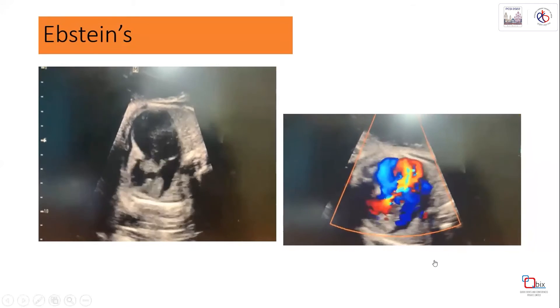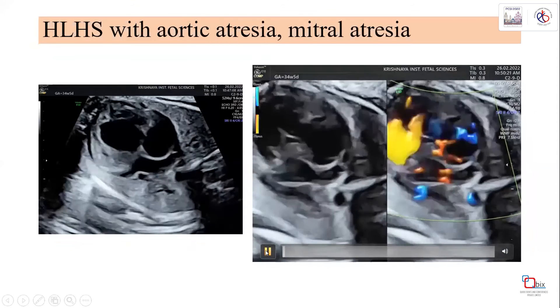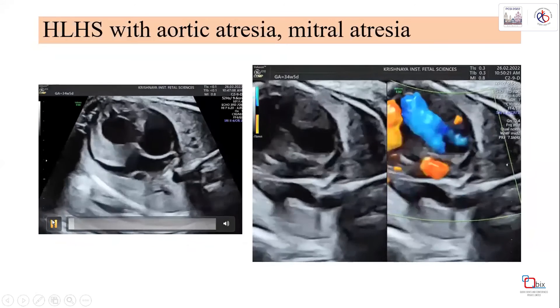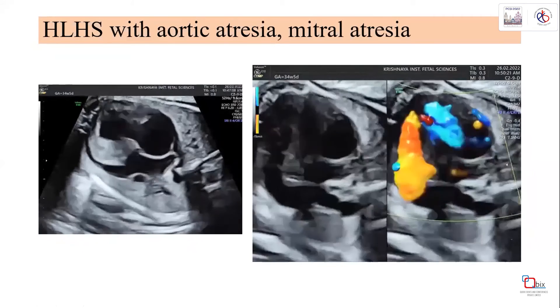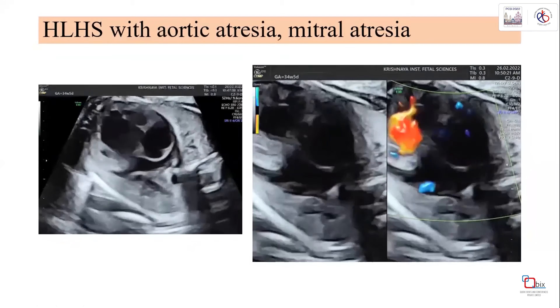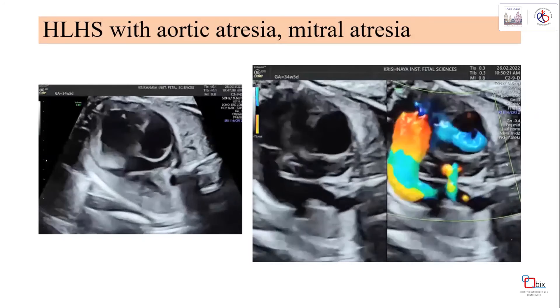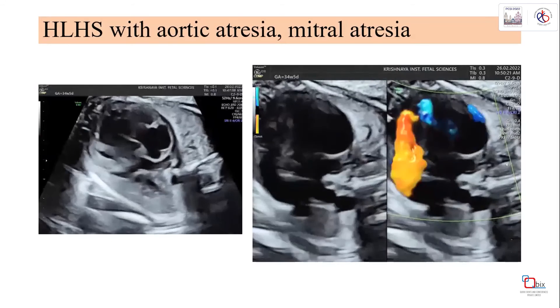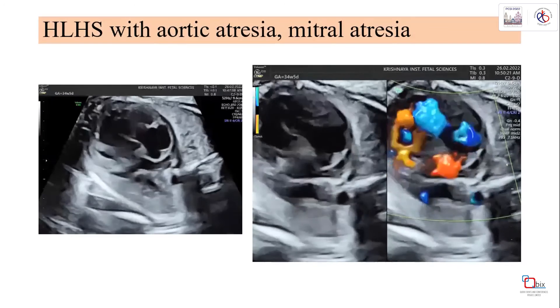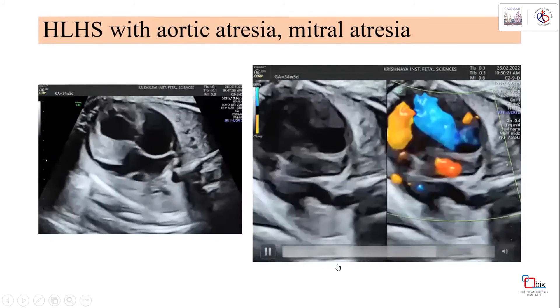Even on low-end machines, a great deal can be diagnosed with color Doppler. This case shows hypoplastic left heart syndrome with aortic atresia and mitral atresia - the blood flow is absent, and the aorta is not seen in the three-vessel view. Following the six cardiac segments systematically from normal findings allows us to differentiate the abnormal.